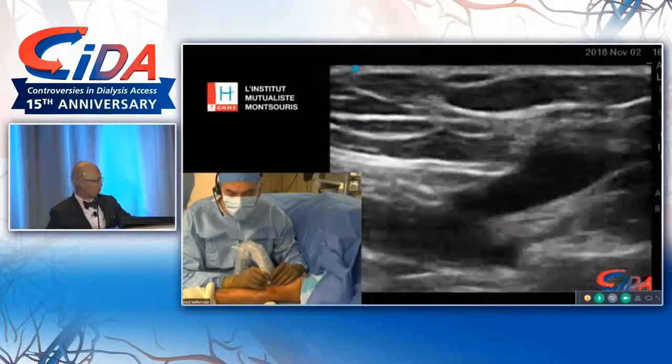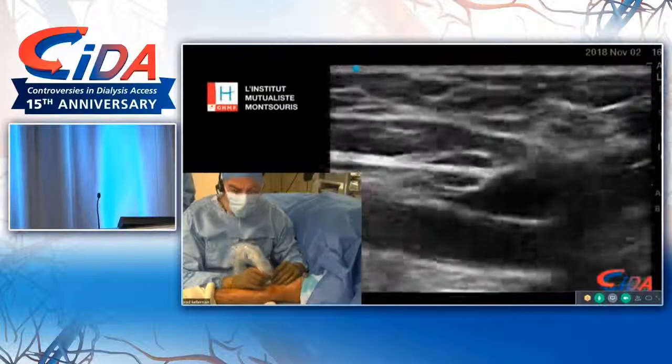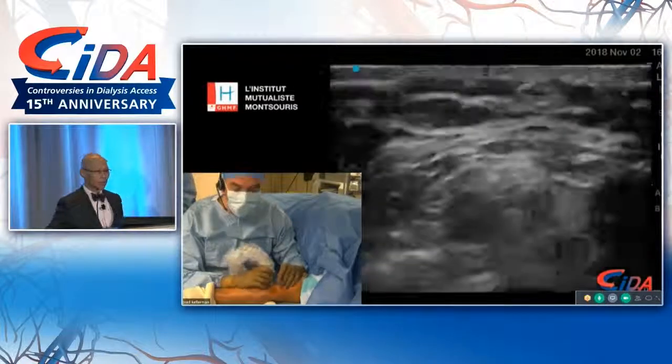Aris, is it feeding the basilic as well? No, here we don't have a median basilic in this patient.